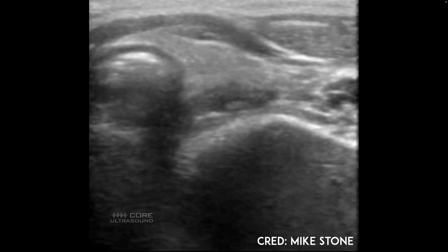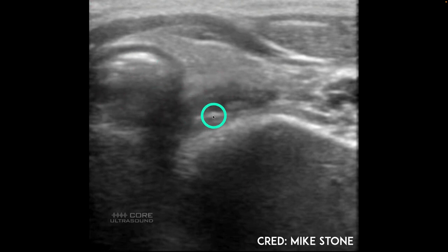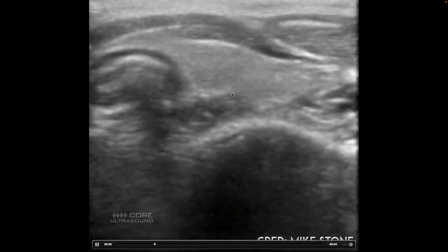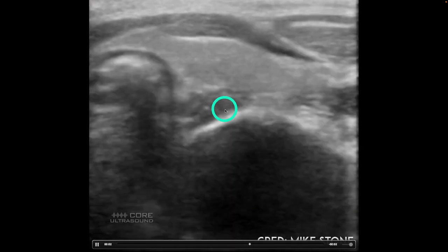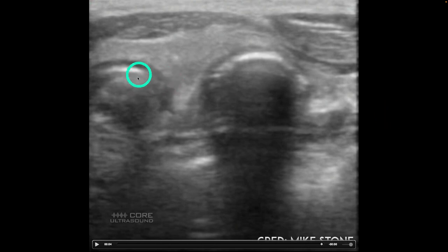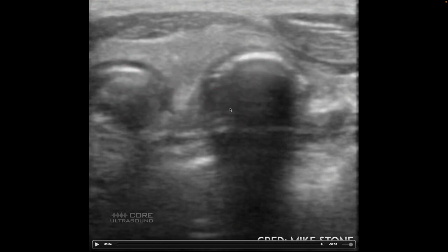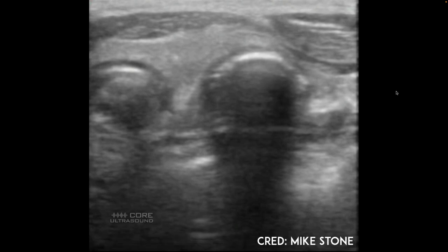So right here we have a linear transducer. We have the trachea here and we can see the compressed esophagus right here. And here we're seeing a little bit of manipulation in the esophagus - and boom, we have two tracheas: one trachea, two tracheas. That is not good. Seeing two tracheas in the neck means that the patient has two circular air-filled rigid structures - one is the endotracheal tube in the esophagus, and the other one is the trachea.